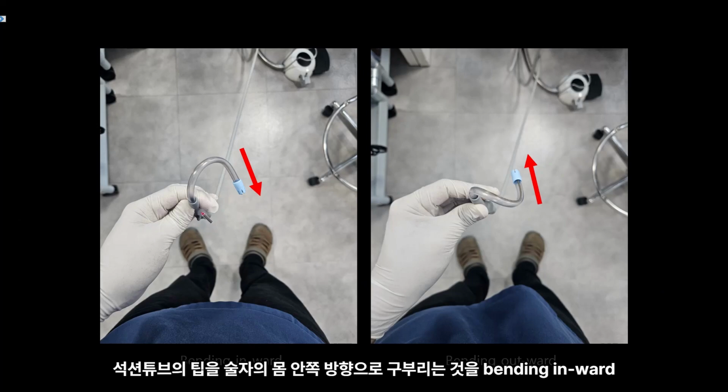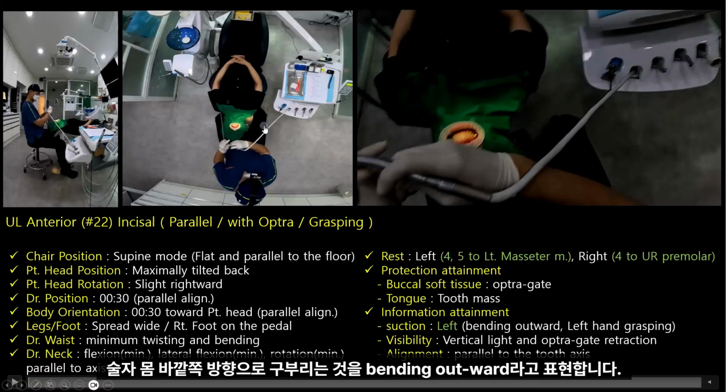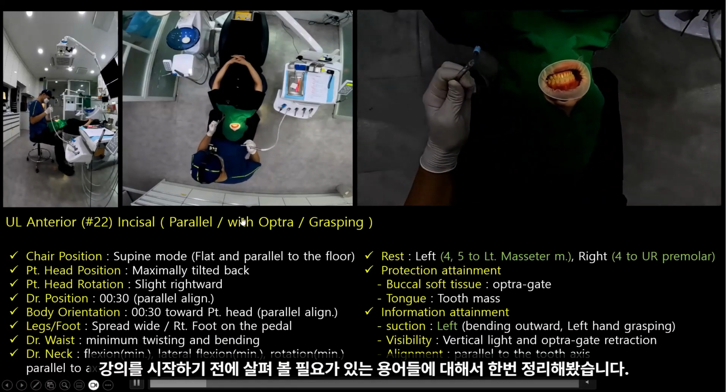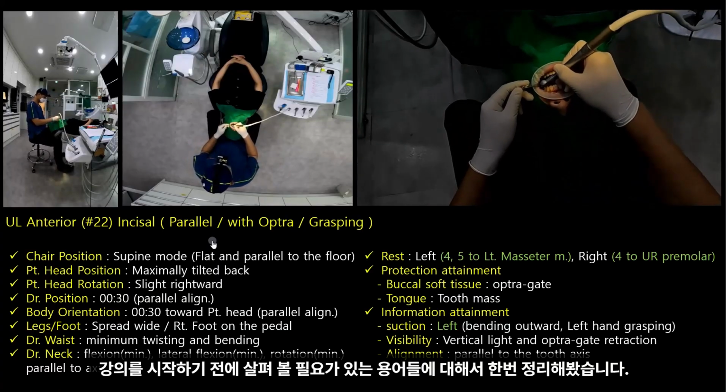We will refer to bending the tip of the suction tube inward in the direction towards the operator's body as bending inward. Conversely, bending the suction tip outward, away from the operator's body, will be termed bending outward. So far, I've summarized and gone over the terms that need to be reviewed before we begin this lecture.